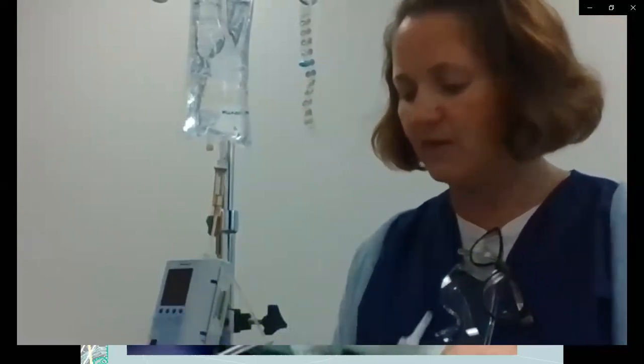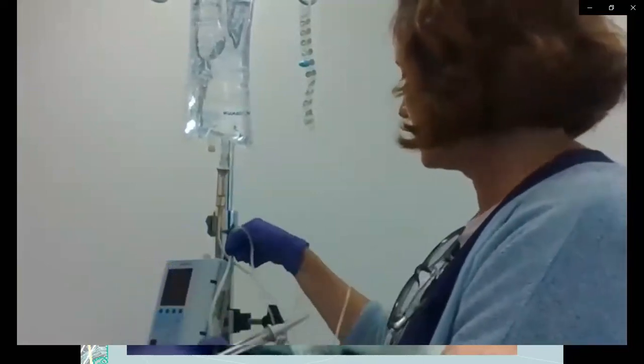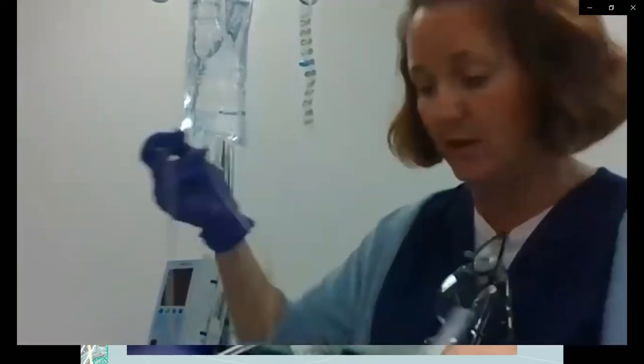Depending on what type of pump you are using, you'll usually have some different type of mechanism on the primary line that makes it compatible with that pump. For this one, it's this little blue slide clamp. It goes in here. I'm not going to put it in there because it's just loud, and sometimes it doesn't want to stop screaming.